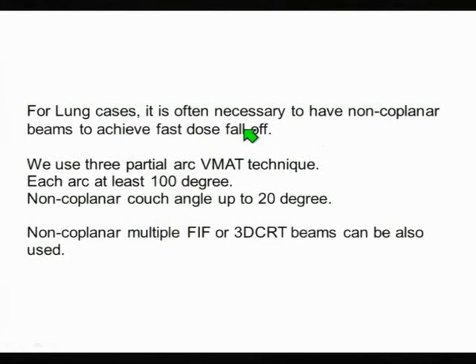For lung cases, it is often necessary to have non-coplanar beams to achieve fast dose fall-off. We now use a 3 partial arc RapidArc technique. Each arc is at least 100 degrees, with non-coplanar couch angles up to 20 degrees. Our machine, because the head is very big, we find beyond 20 degrees it is very difficult to clear. Before RapidArc, we used non-coplanar multiple field-in-field or 3D CRT conformal beams.